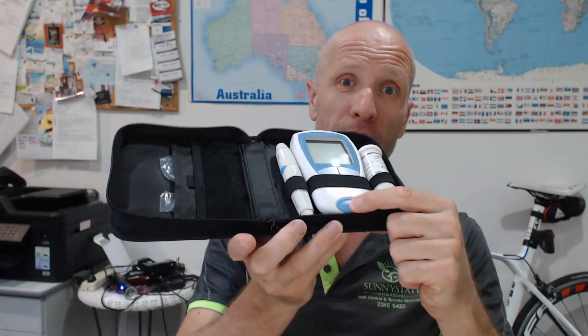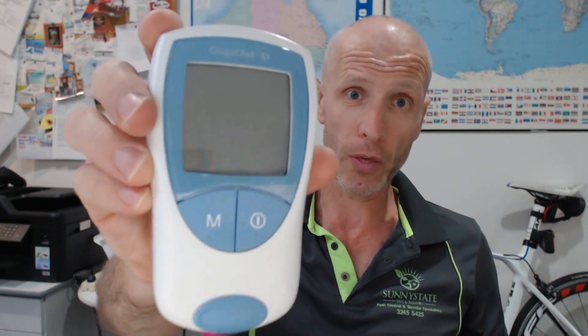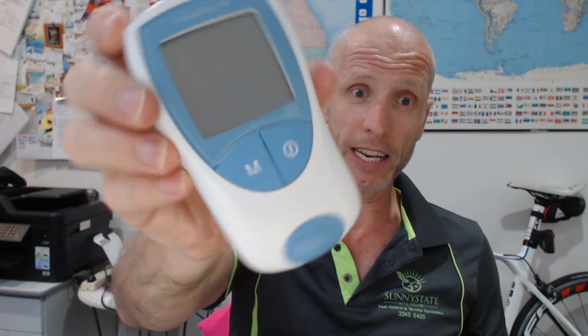When they draw the blood, you stick one of your strips in and get them to put a bit on there. When you get the results back the next day, you compare — if theirs matches yours, the calibration is fine. I do that about once a year. The machines are now $589, not a thousand dollars anymore. You can find them on medshop.com.au.